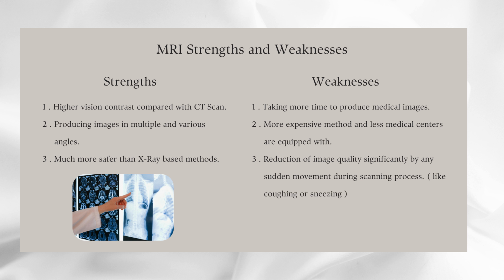And weaknesses are: 1. Taking more time to produce medical images. 2. More expensive method and fewer medical centers are equipped with it. 3. Significant reduction of image quality by any sudden movement during the scanning process.